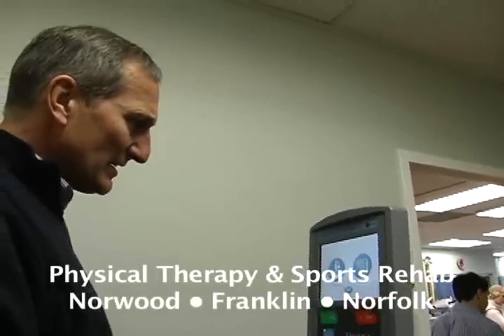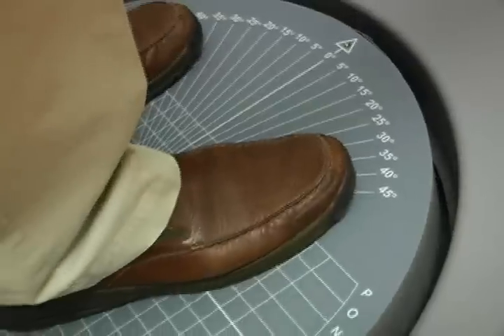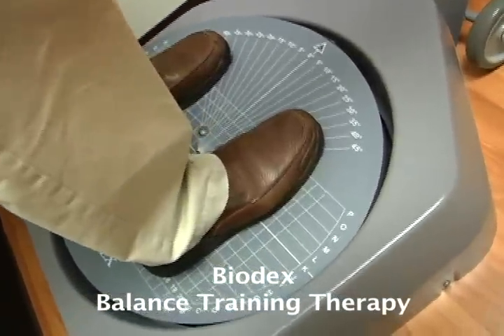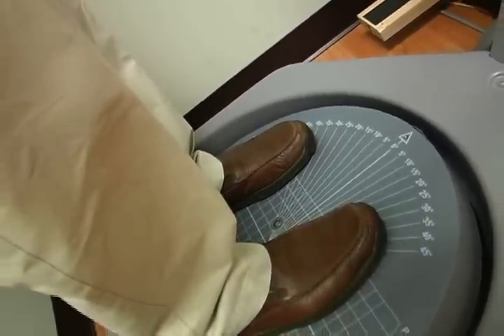The Biodex allows us to test clients as to where they're weight-bearing — whether they're more forward or back on their heels — which would be potentially a leading indicator for balance problems or falling problems. So we're looking at a fall prevention type of program when we're working on the Biodex.